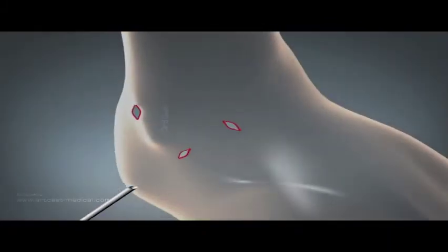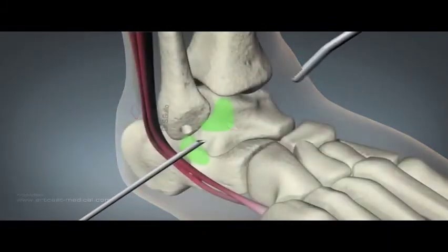The inferior lateral space is cleared further using the accessory and anterolateral portals. The junction of cartilage and bone on the talar body marks the ATFL insertion.